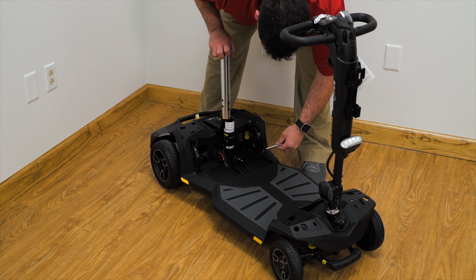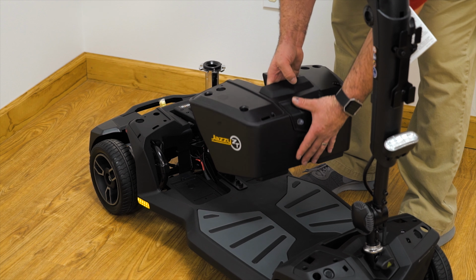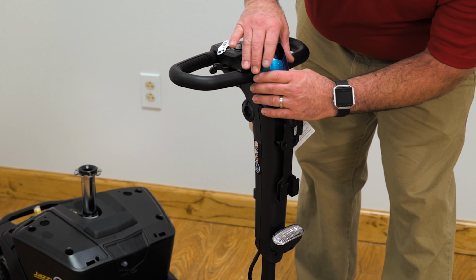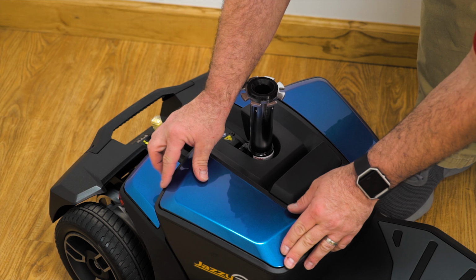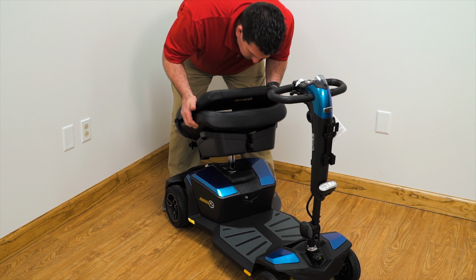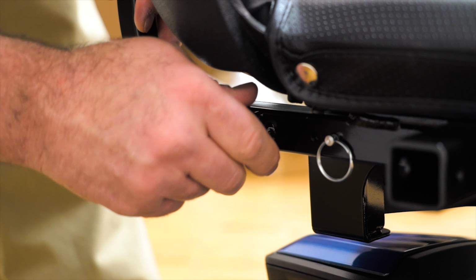When assembling, place the seat post in the frame, setting it at the desired height with the large detent pin provided. Next, set the battery box in place, followed by the colored shrouds. Place the seat on the post and set the desired width of the arms using the smaller detent pins provided. Then tighten the thumb knobs.